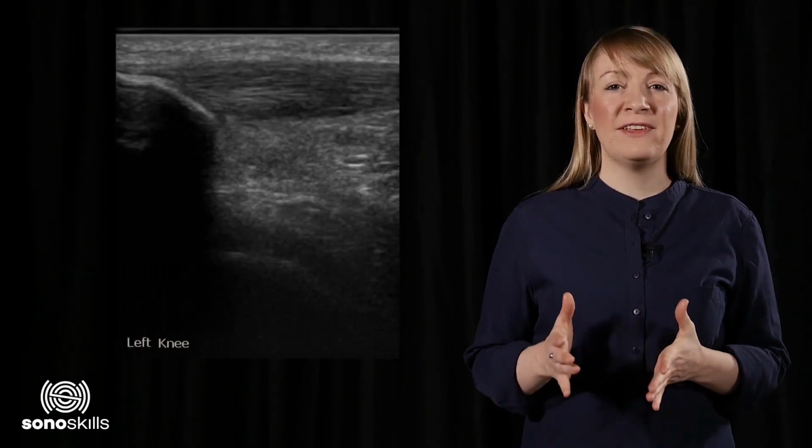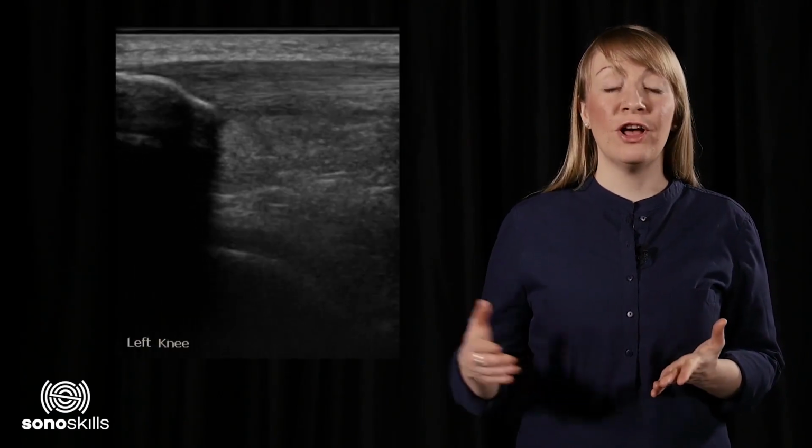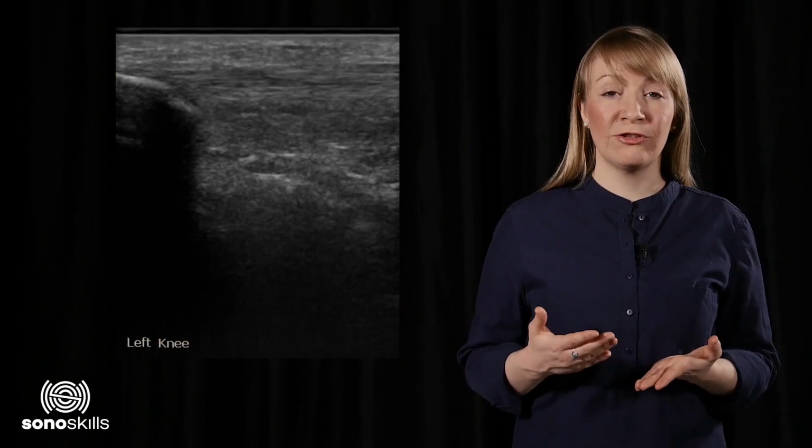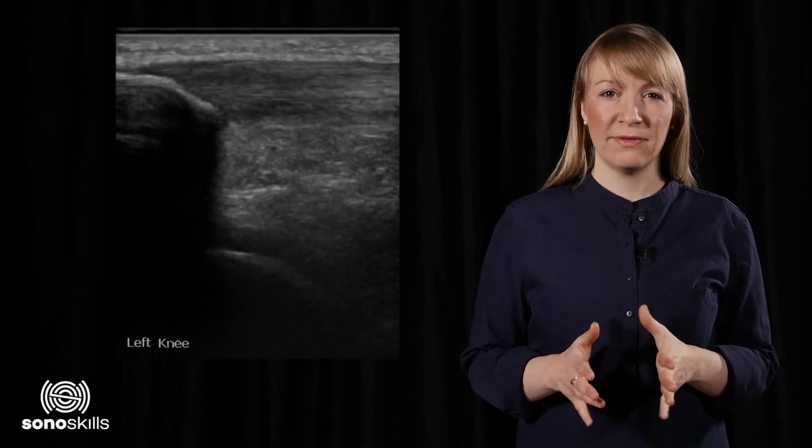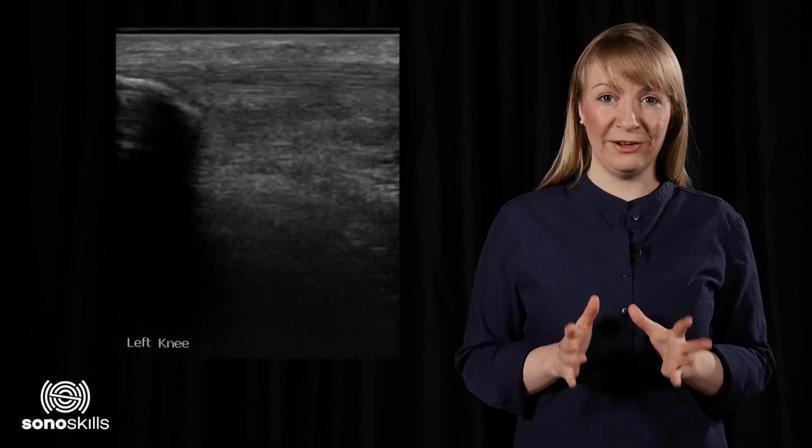This clip shows the patellar ligament and the transducer that sweeps from medial to lateral and back. Please note the tendinopathy in the middle and the healthy fibres on the lateral and medial side of the tendon.